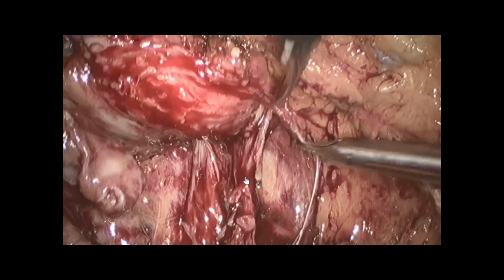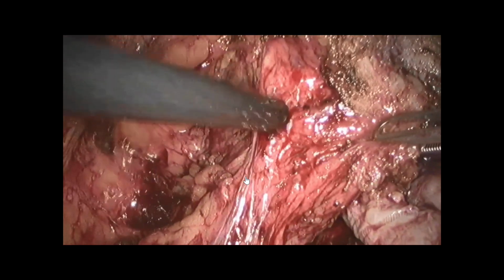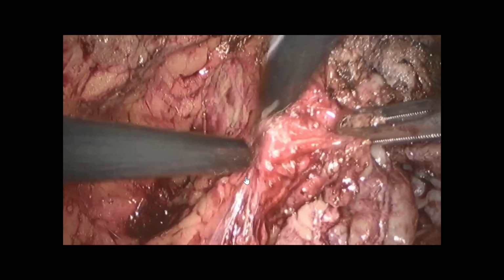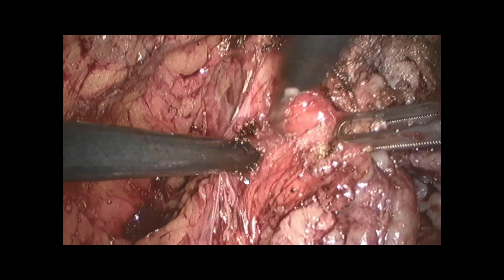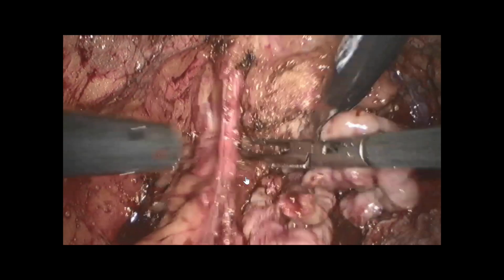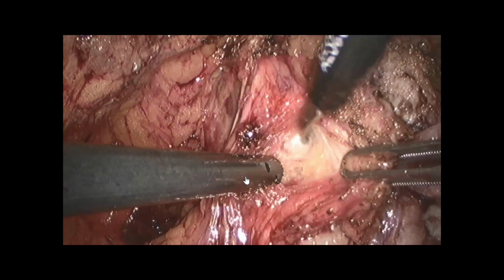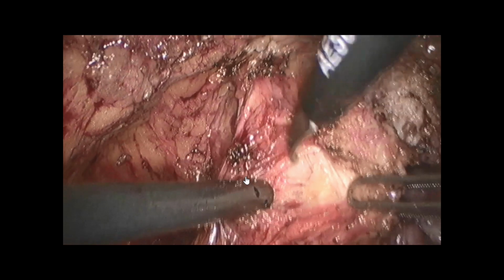But at the end you have to stop because the end of the bundle is going towards the urethra. On the right side you see that the endopelvic fascia is not open because I will preserve. There is no positive biopsy on this side, and also because he has an accessory pudendal artery. So here what I'm looking for is the contact with the prostate immediately. This is important to find the contact. You see this white aspect, this is the contact.